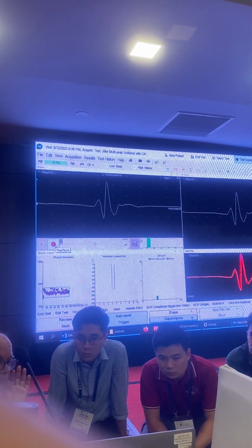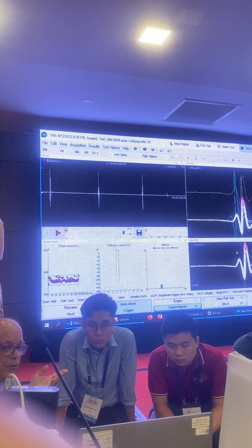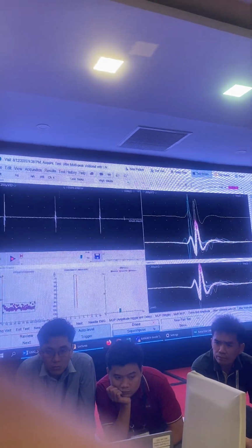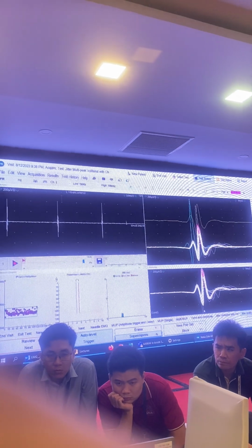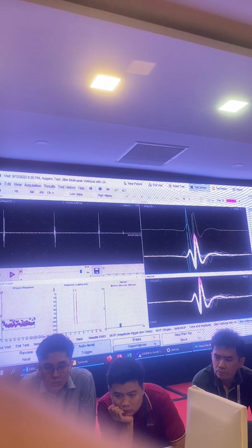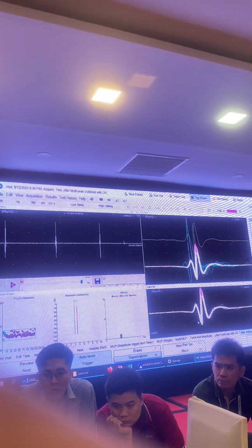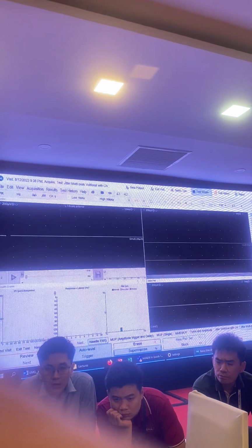And I stop. It has automatically analyzed the signals. It has rejected the bad trace, everything. But it's still my responsibility to check over here and see there is a bad trace over here, some large spike. So I get rid of it manually over here. And there are some low amplitude potentials. I get rid of that. Now that's clean over here. Let me go to the next.